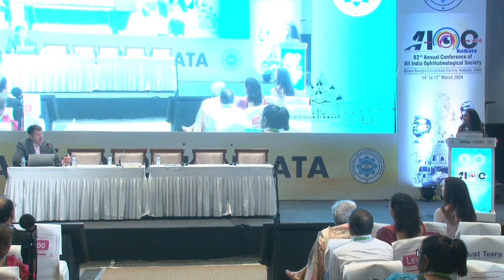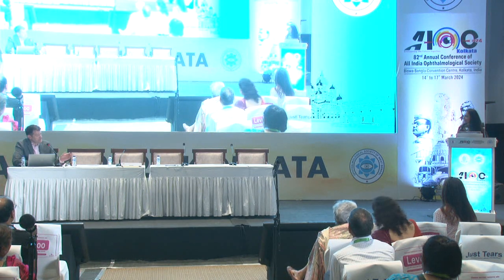So do you have any suggestions for those in the audience who are thinking about putting a toric in a keratoconic? Is there an age cutoff? Is there things you look for in an exam to look at and say, is this person going to become one of those who's going to get that inferior ectasia and therefore may not be a good candidate for a toric IOL? Yeah, no, that's a great thought.